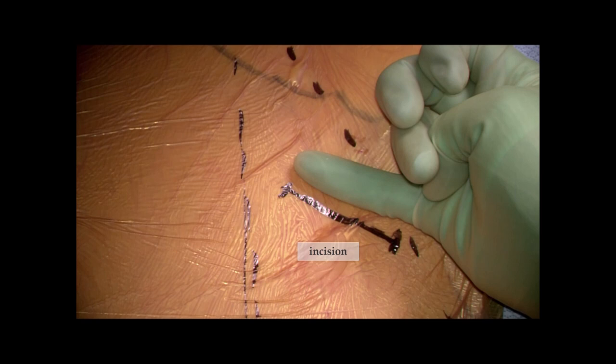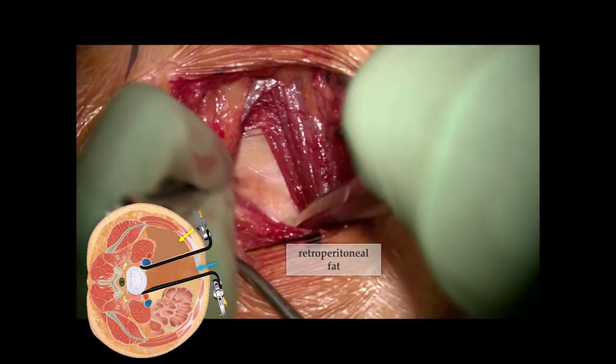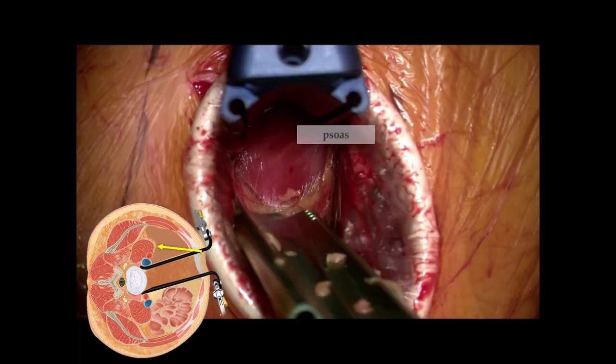The incision is marked here at about four to five centimeters — in reality typically about six centimeters at minimum to ensure you can get the appropriately sized cage down at L5-S1. The L5-S1 disc space is marked at the top, and you have the sacral slope with a perpendicular line indicating your incision site. When you open the skin and get down to the external oblique fascia and open that up, the first thing you'll see are the fibers of the external oblique muscle. When you open those fibers, you'll be in the retroperitoneal space — shown in the bottom left inset.